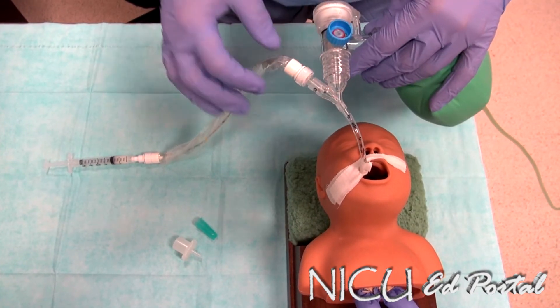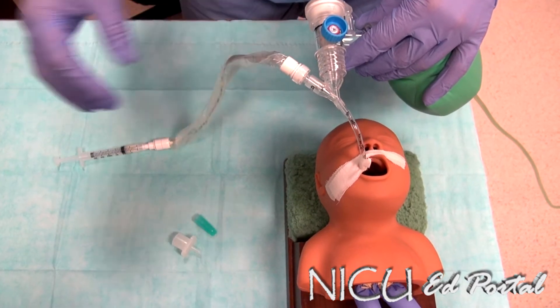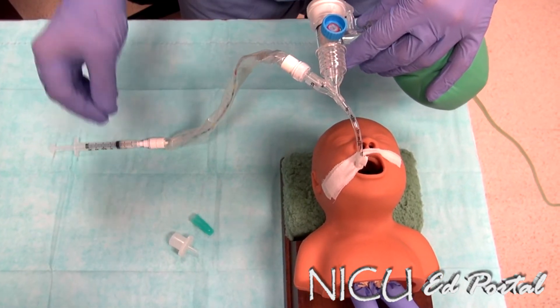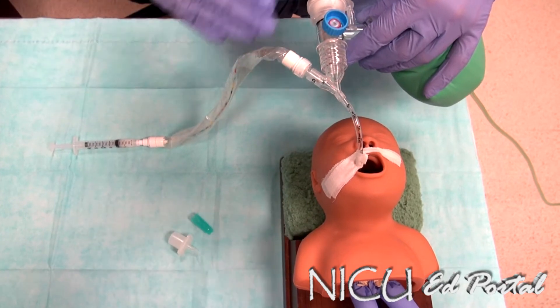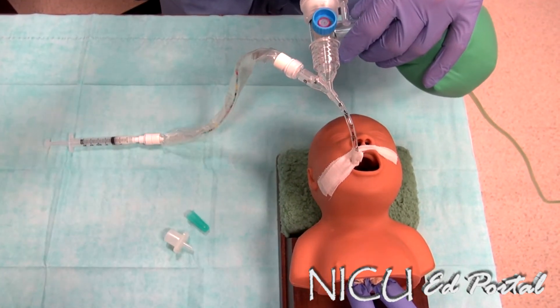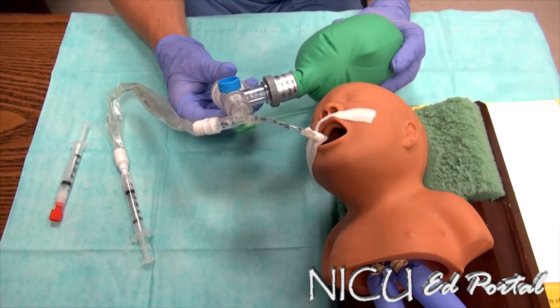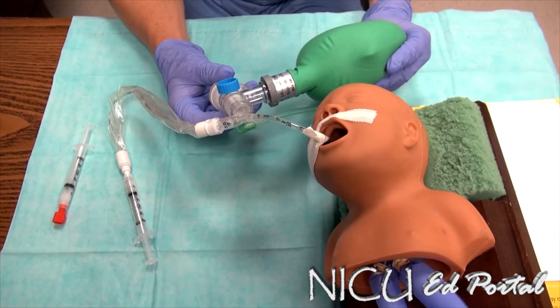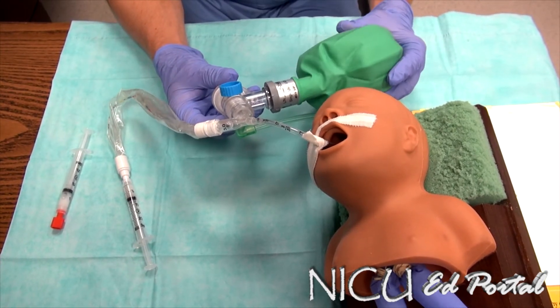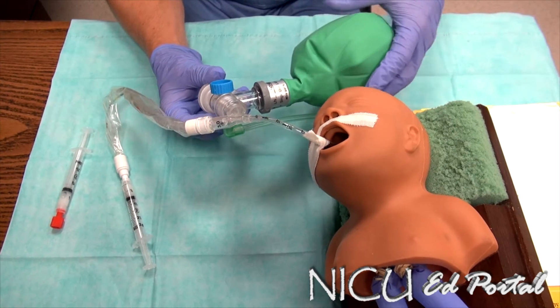That's the demonstration of inserting the catheter. We can also demonstrate giving both aliquots, tilting the baby to the right and to the left. Here we have the baby tilted to the right side, and we are about to give the first aliquot.